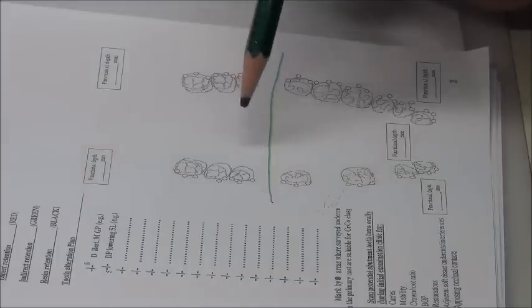طيب الميجر connector did we change it? Horseshoe if the patient doesn't tolerate it. If the patient tolerates palatal coverage, I do full palatal coverage. Okay? See the change in the major connector now. طيب حطينا retention, حطينا reciprocation, حطينا الميجر connector and finished. What else do I need?